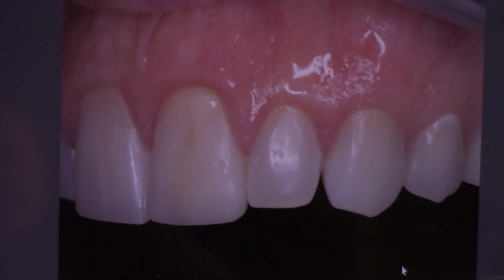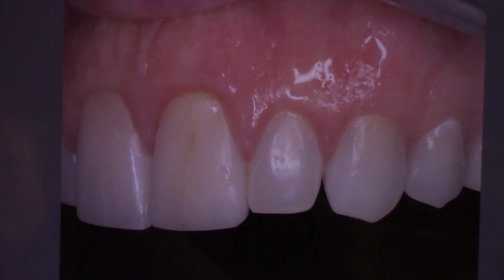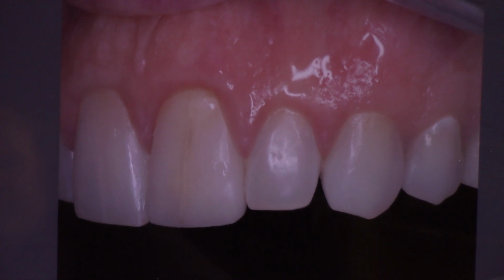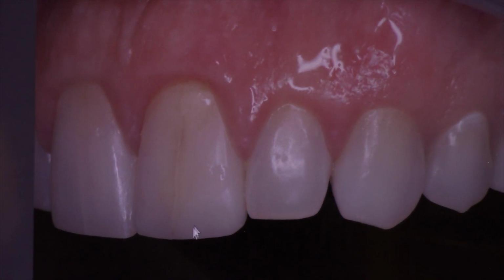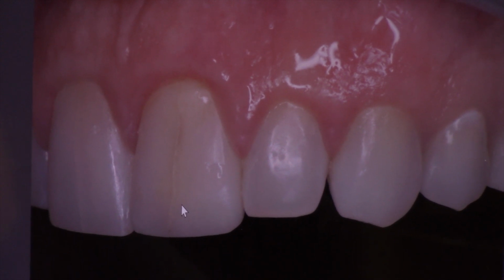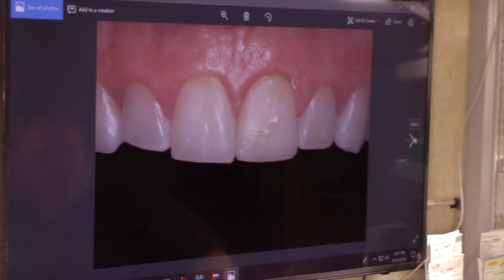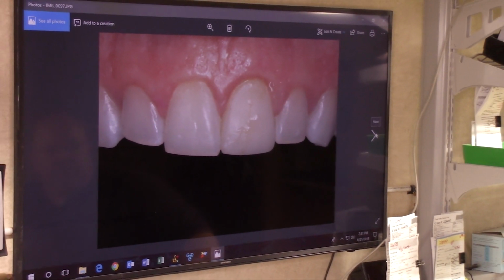So I took lateral pictures. Obviously, I wanted to show the nuances of the translucent edge, and what's interesting on this one is, just like I like with my veneers, you see that amber halo. And if we didn't have a good photo of this, he wouldn't be able to see that amber in the incisal edge, and then my single crown or my single veneer would not look like the rest of the teeth.